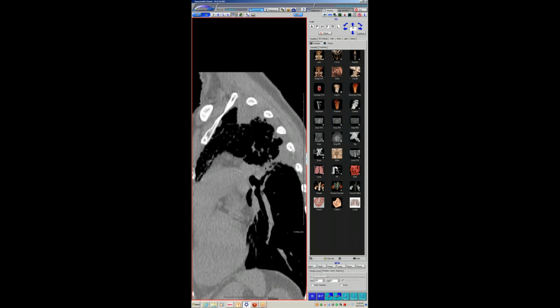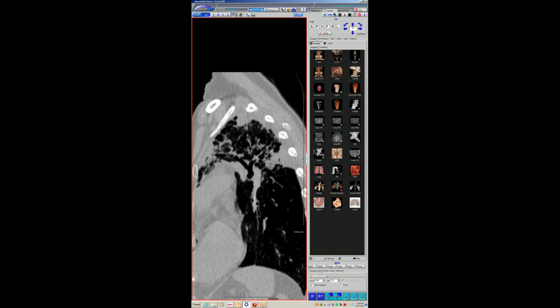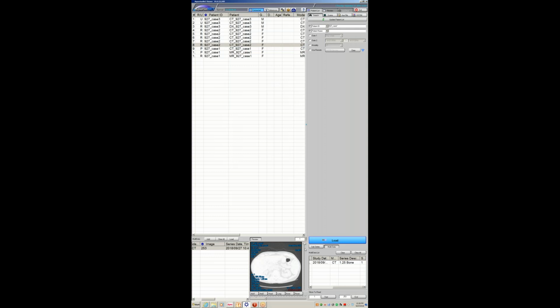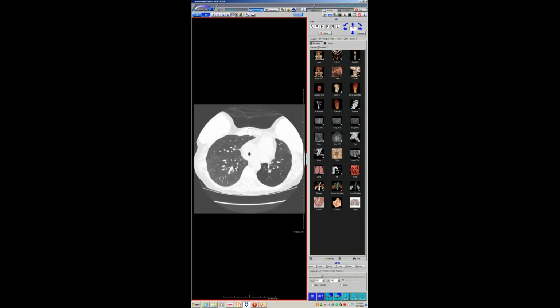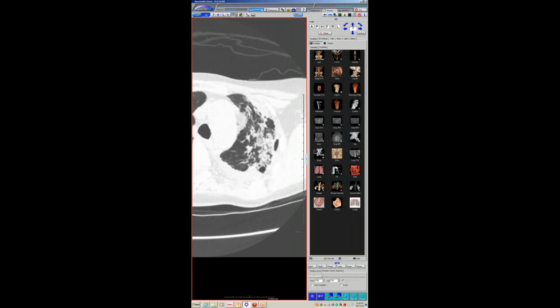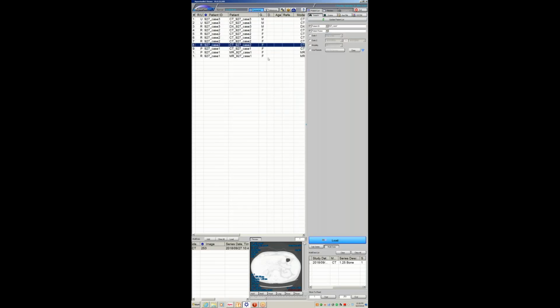I think we're agreed on the core thing here, that this is a pattern of lung scarring that is related to chronic rejection. Yes. The other indication of chronic rejection is the constrictive bronchiolitis which she has in the lower lobe, which is kind of neat. And given how acutely this came up, over 14 months, that's a little atypical for upper lung scarring from rejection. That suggests some acute insult, such as infection. That's what I was talking with the pulmonologist about, and that's what he thought. He thought she got infected and then went downhill from there, and that's why they gave her another lung transplant on the right.